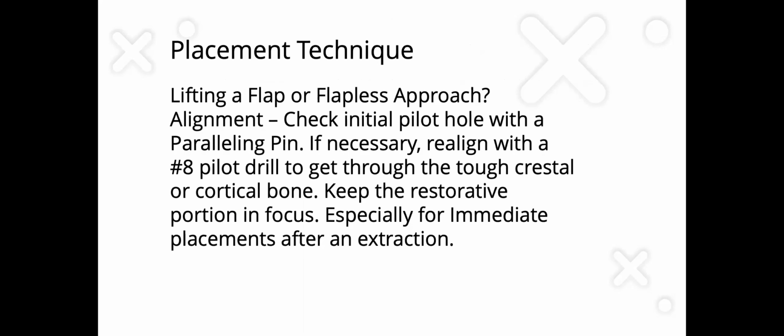So are you going to be lifting a flap, or is it going to be a flapless approach? That's a question that you'll be considering. Maybe even at the time that you see the patient, you were planning on lifting a flap, and you realize you can probably do this in the flapless approach. Check the alignment. Make sure that you use your paralleling pin if necessary, and then realign. Sometimes you're not going to like your alignment, and so you have an opportunity to realign with your number 8 high-speed round burr and your pilot drill to get through that tough crestal or cortical bone.